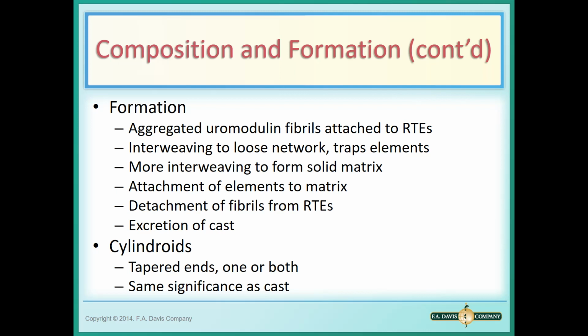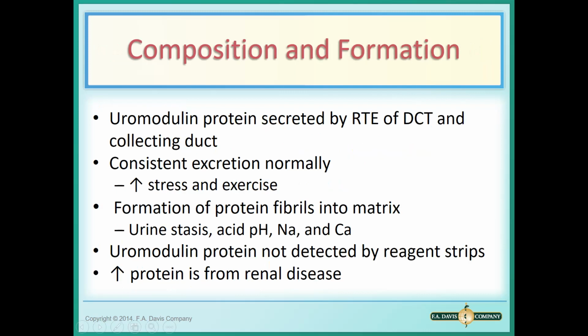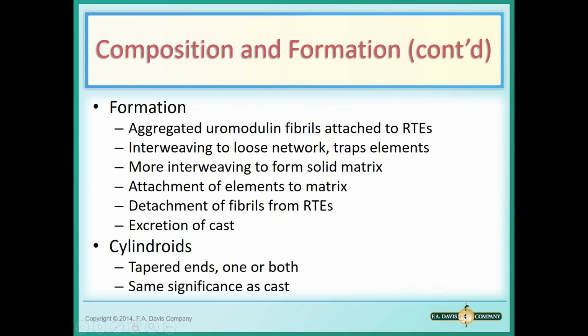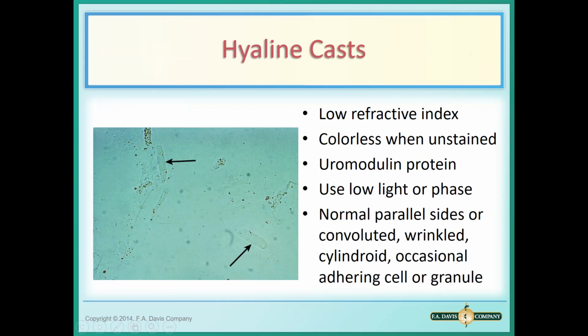Clinically significant, same significance as a cast, but it doesn't take on that parallel side. It doesn't have the parallel sides and rounded ends. What it has is a very tapered edge on one or both of the sides. It's kind of a long string on the end of a cast, but it's clinically significant because it's really the same. Hyaline casts are the first ones we're going to look at.